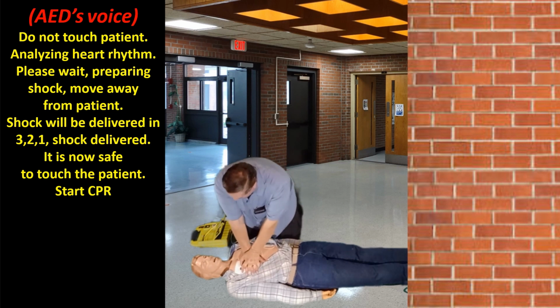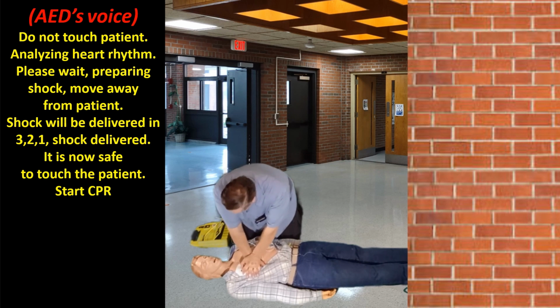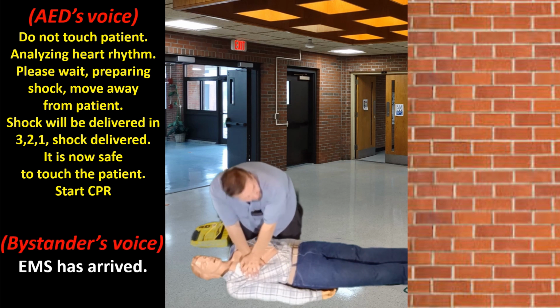1 and 2 and 3, 4 and 5 and 6, 7 and 8, 9 and 10 and 11 and 12, 13 and 14 and 15. Staying alive. Staying alive.